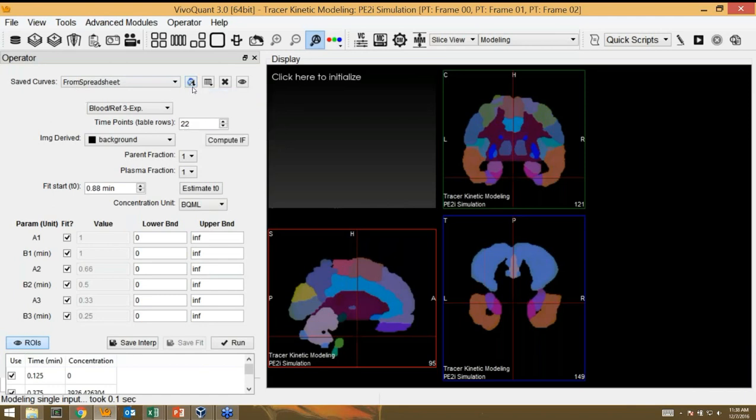That said, we can also save and load curves from the IPACs or from the disk. So here I can load from the IPACs. I already had a curve stored for this data set. One of the reasons that this is very powerful, in my opinion, is for running multiple modeling routines on the same data set. We can save that curve once to the IPACs and then pull it down subsequently for additional iterations of the tool, which is very powerful given the availability of the VivoScript platform.